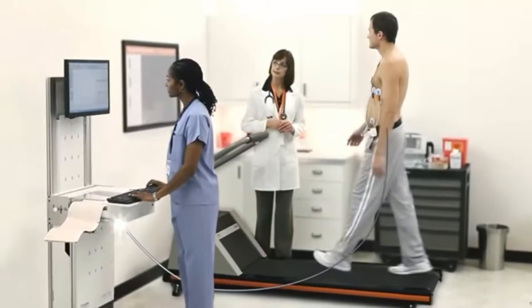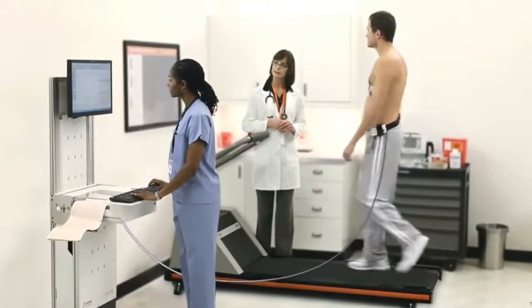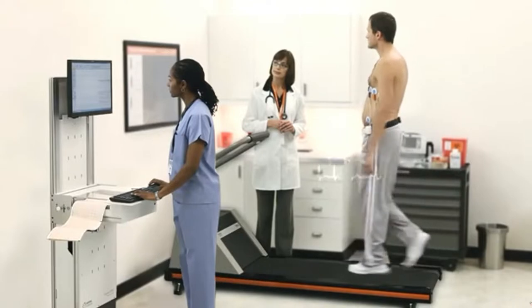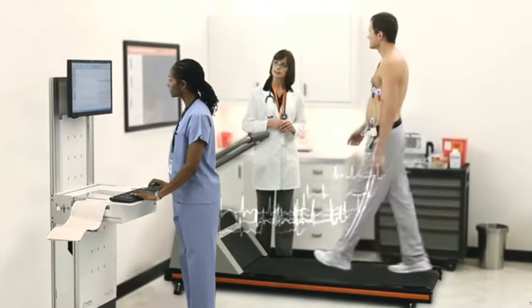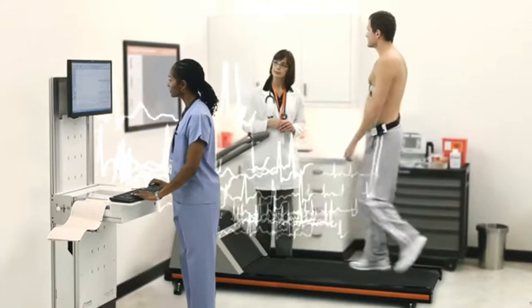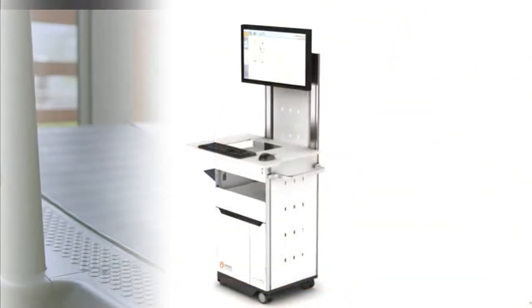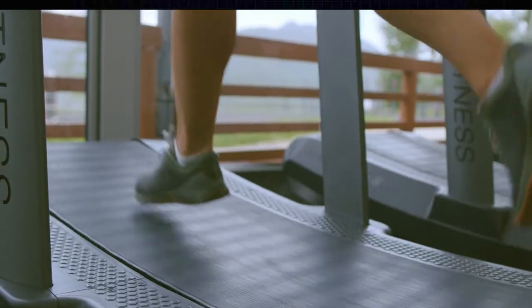First of all, what is a positive, negative, and inconclusive report? Basically, a treadmill test is a stress test in which we ask the patient to walk briskly on a treadmill — like a routine treadmill found at a gym or at home — where the treadmill roller keeps rolling and the patient is made to walk briskly over it.